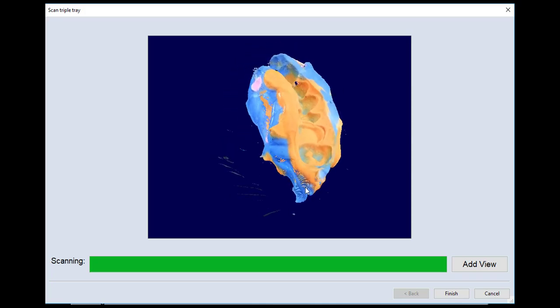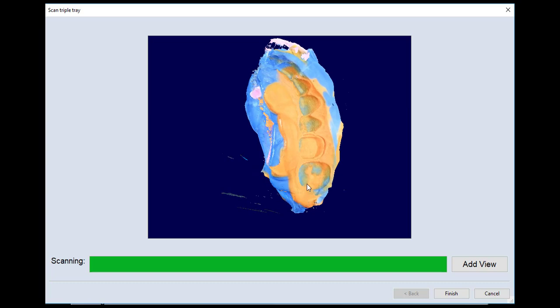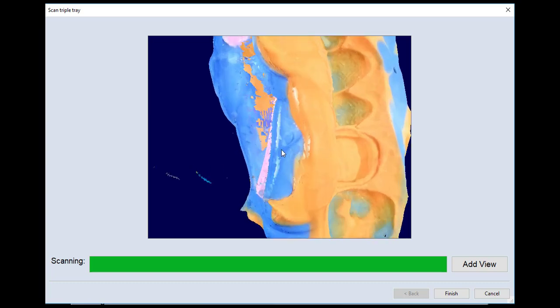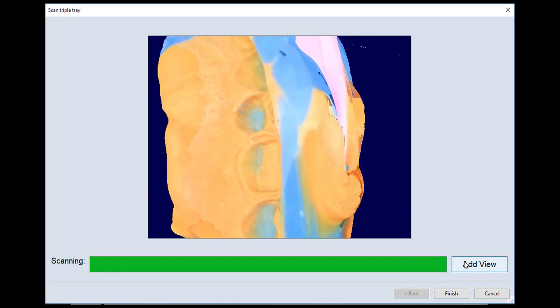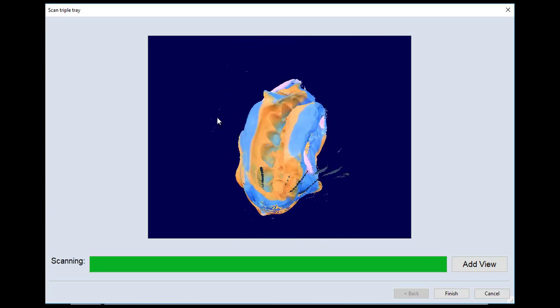So what I'm doing is I'm looking at this and I'm just making sure that on all the critical areas there's no missing data. If you did see any missing data, then what you can do is orient the scan to where it looks into that area of missing data and hit Add View, and it will go back to that position and capture a little bit more data.